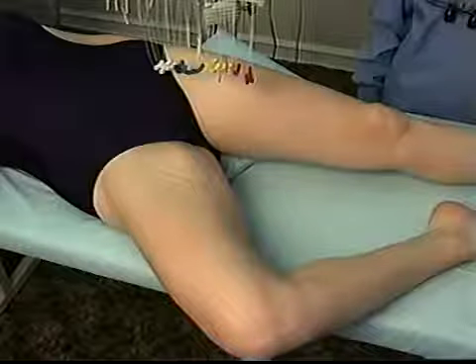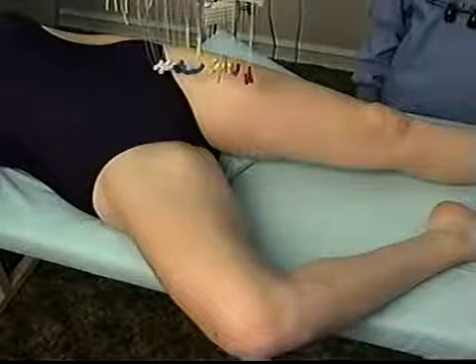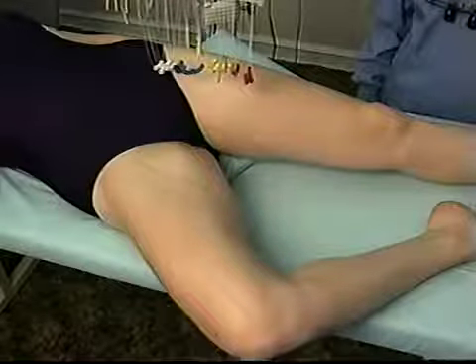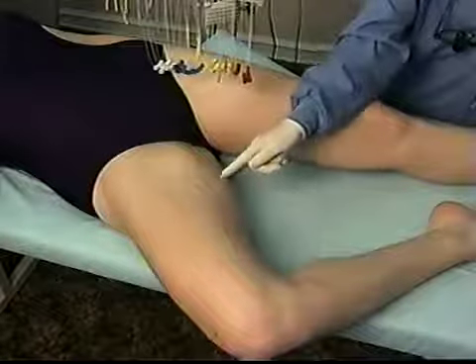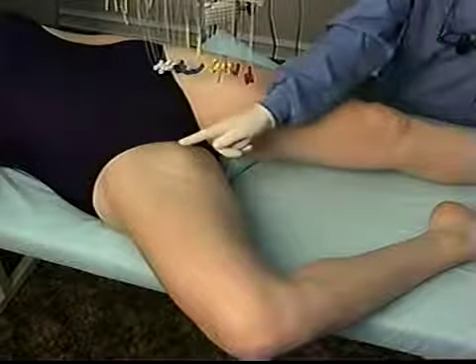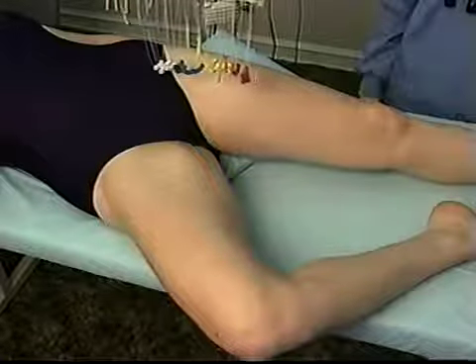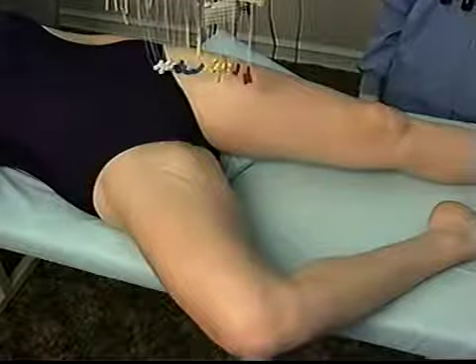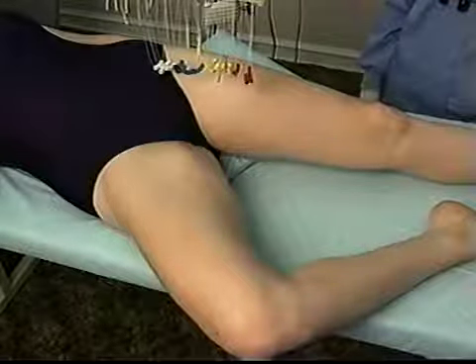The groin and the thigh can present many problems. You have to consider the age and flexibility of the patient. The hair on the thigh generally grows in the shape of a triangle. It may be just a small amount of hair, or it may be quite extensive. I generally begin with the patient on her back. I start to treat the outer edge of the triangle.